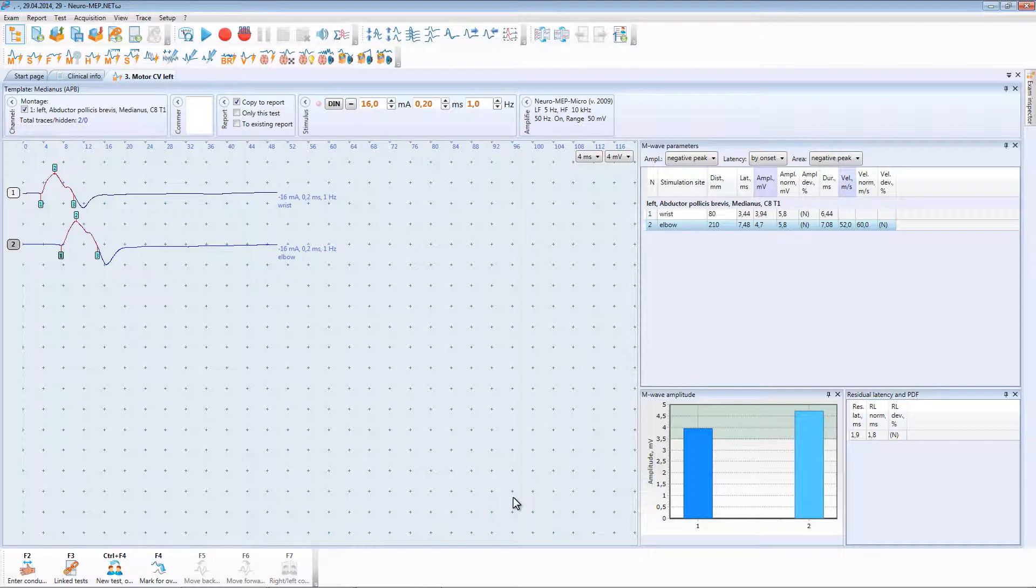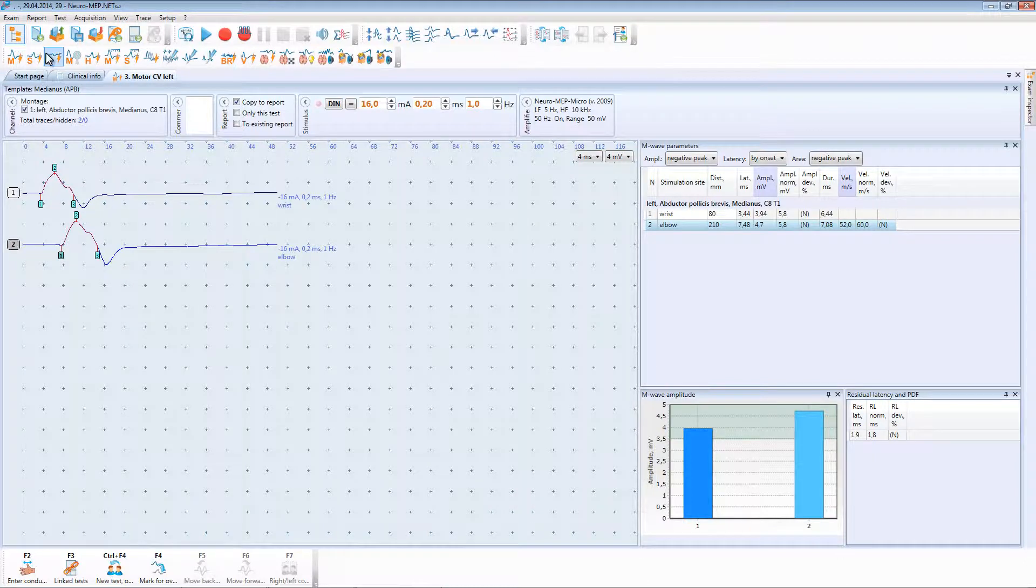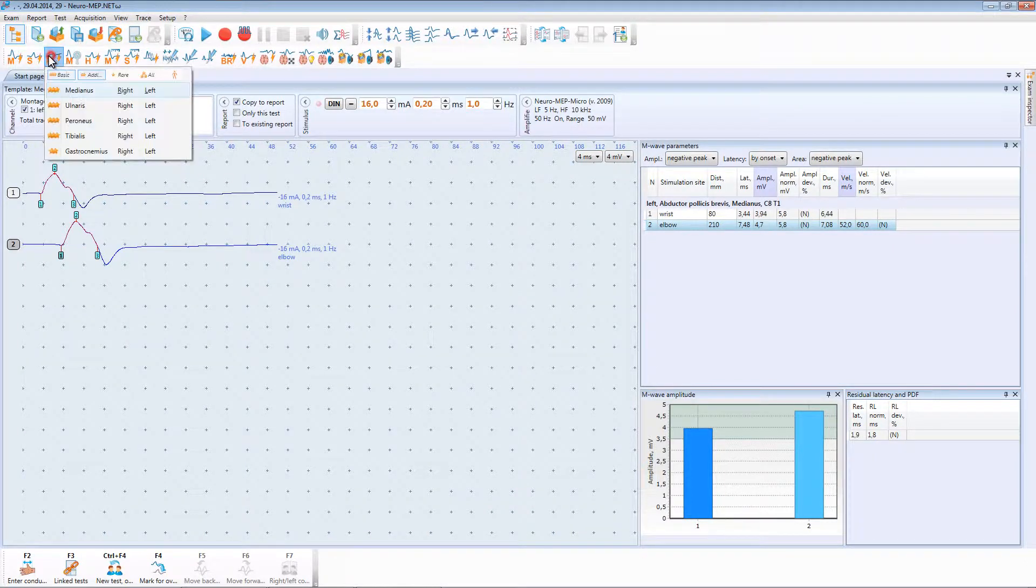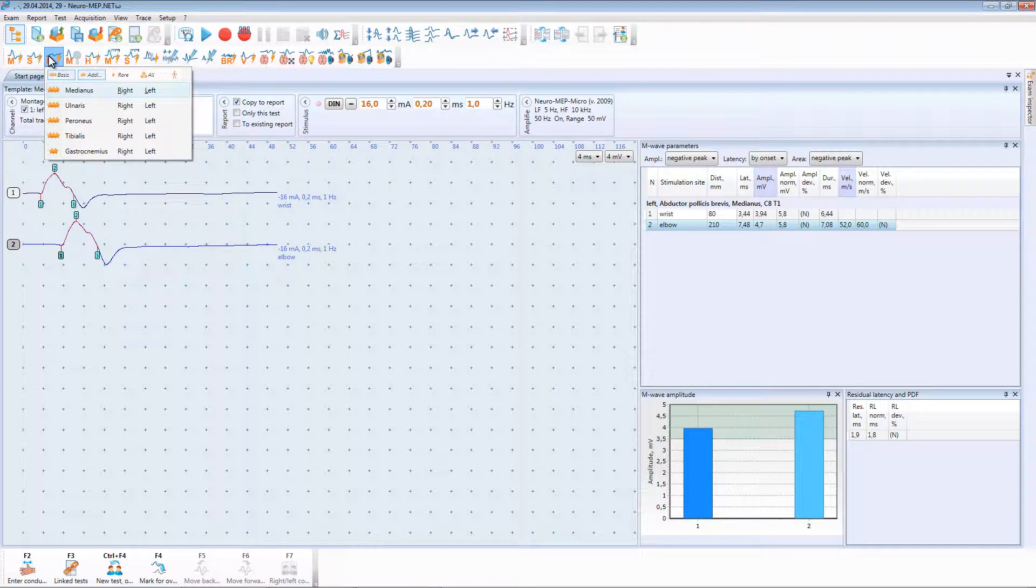To study proximal parts it is recommended to use F-wave technique. To run F-wave technique you can use the following ways: you can use F-wave toolbar button, choose medianus nerve and left site.